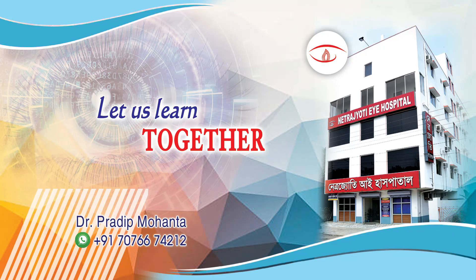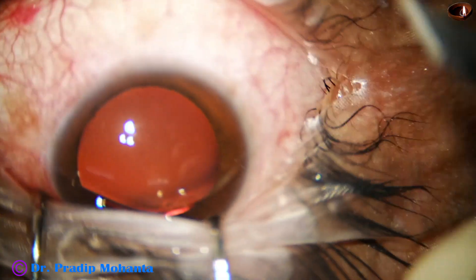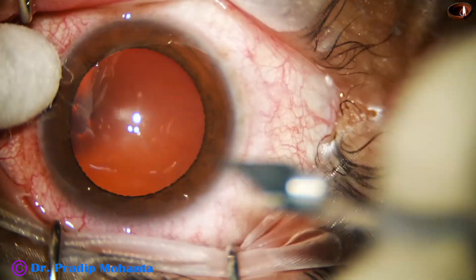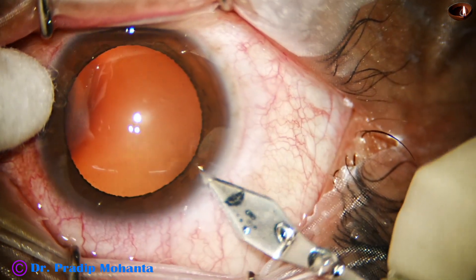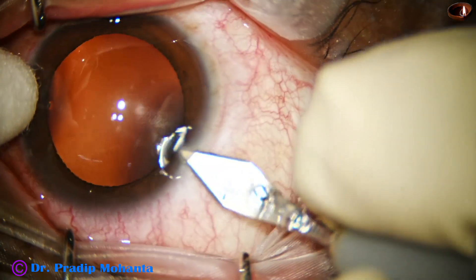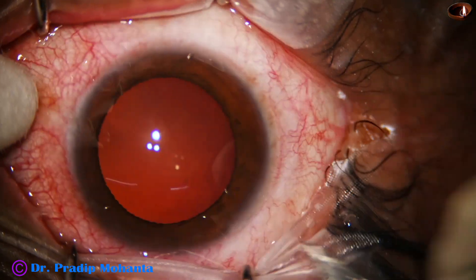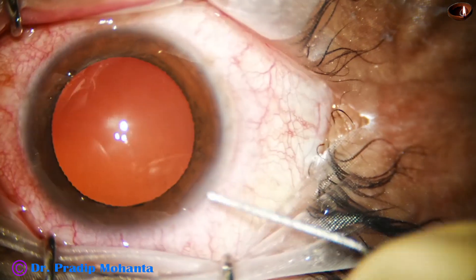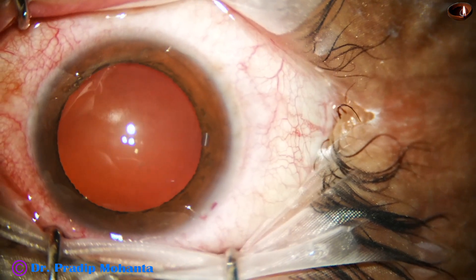Welcome to my workplace at Ranagha, West Bengal, India. This is a highly myopic eye with an almost clear lens — nucleus sclerosis is grade 1 or so. The patient is highly myopic, under topical anesthesia, and I am expecting LIDRS in this case — lens iris diaphragm retropulsion syndrome.